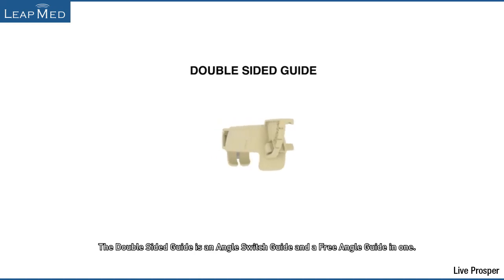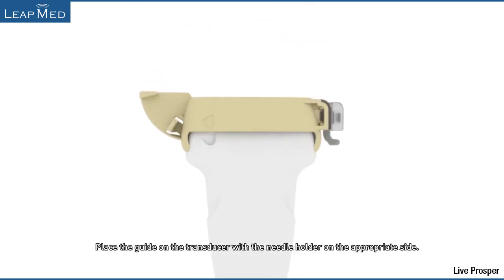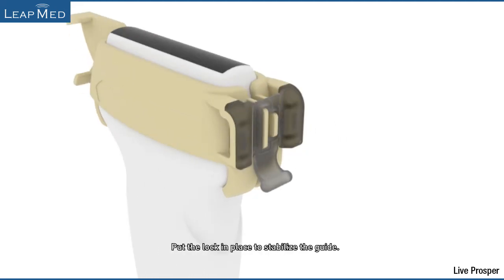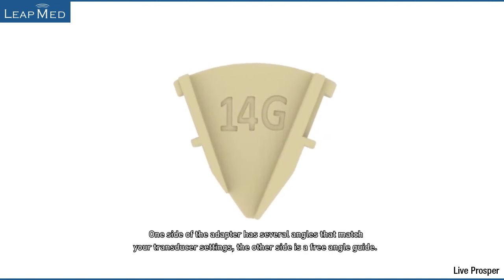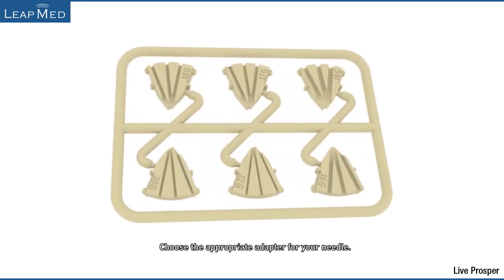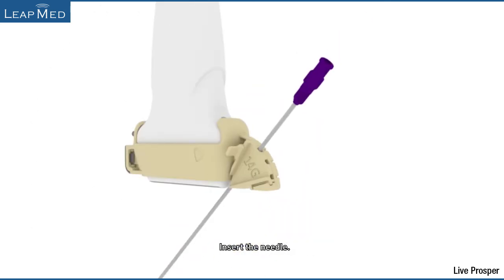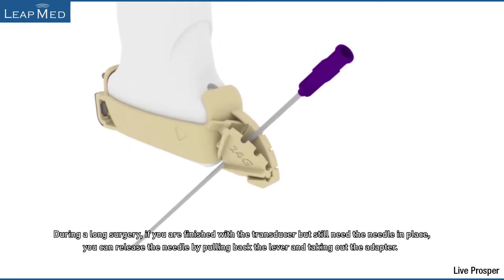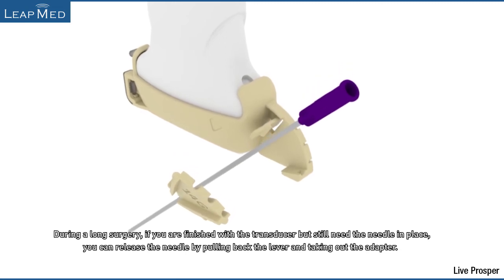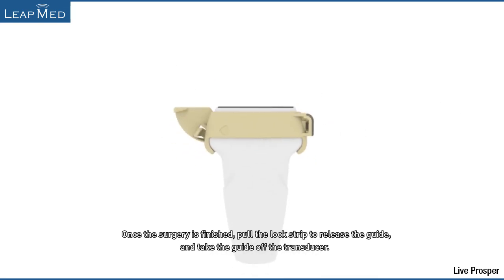The double-sided guide is an angle switch guide and a free angle guide in one. Place the guide on the transducer with the needle holder on the appropriate side. Put the lock in place to stabilize the guide. One side of the adapter has several angles that match your transducer settings; the other side is a free angle guide. Choose the appropriate adapter for your needle and install the adapter into the guide. Insert the needle. During a long surgery, if you are finished with the transducer but still need the needle in place, you can release the needle by pulling back the lever and taking out the adapter. Once the surgery is finished, pull the lock strip to release the guide and take the guide off the transducer.